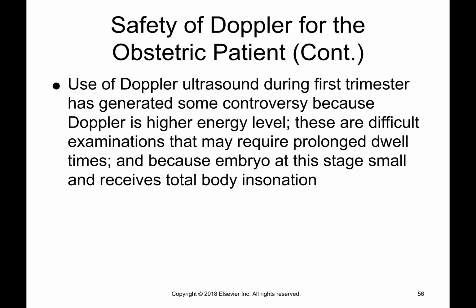So to document the heart rate, what we do is M mode, which I'll show you guys too. It's just a motion mode. So we are able to track the heart rate that way, but it doesn't have as high energy as the pulse wave does in the first trimester.